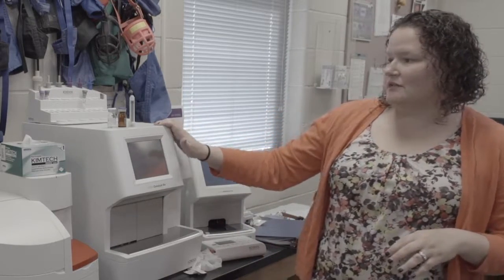Okay. So that's going to take it a few minutes. Just a reminder when you're doing this, the longer the doors are open, the longer it's going to take to come back up and be ready. So the first few times you do this, give yourself a good 15 to 30 minutes before it's going to be ready to use again.